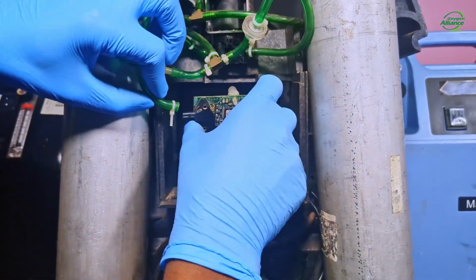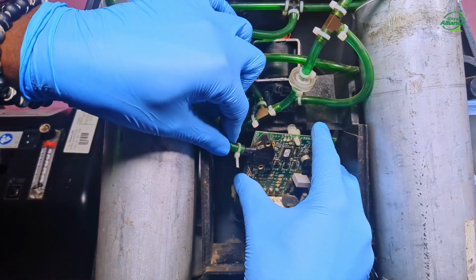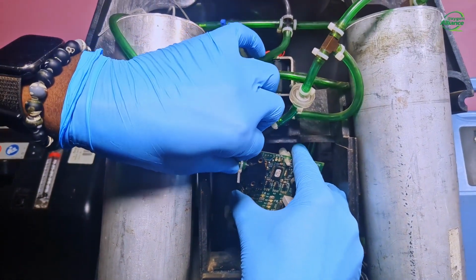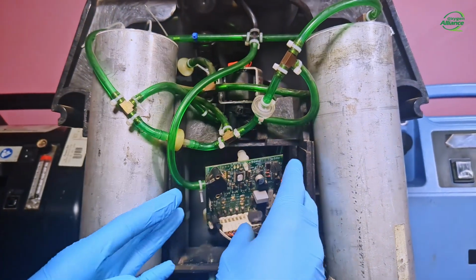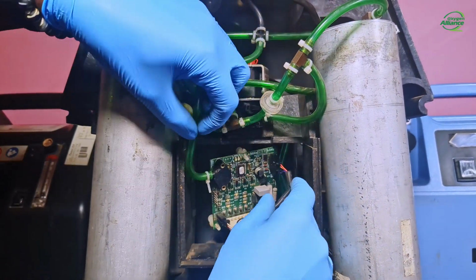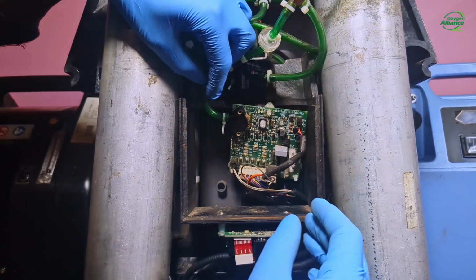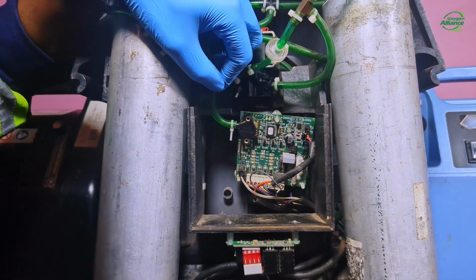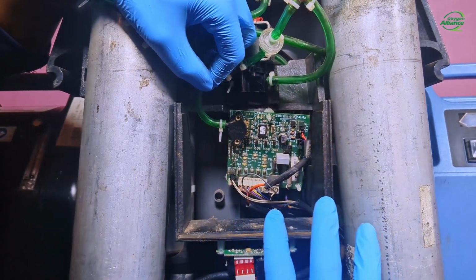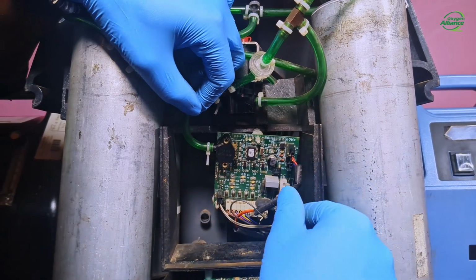This is a tube that is connected to the pressure sensor. So there are several components that are connected to this board.